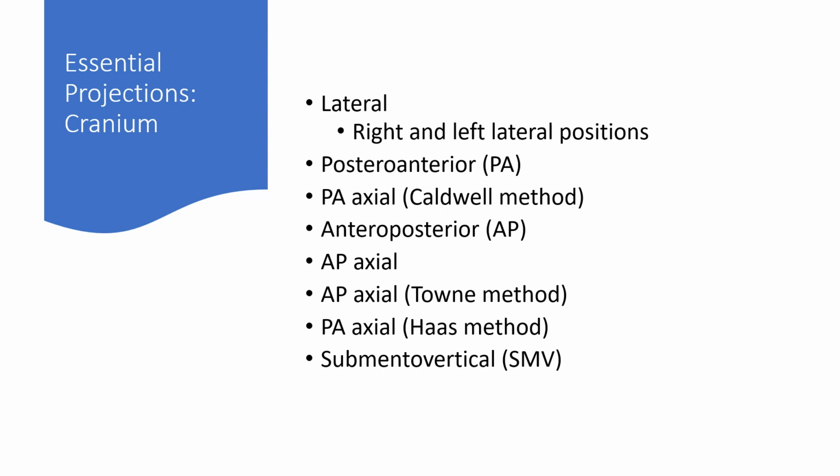So it might be that for an assault, you might be taking both a left and a right lateral projection for the same study, because the left side of the face might have different injuries than the right side of the face or the left side of the skull, so on and so forth. So getting both the lateral projections, make sure that the radiologist can see the side down with clear detail.